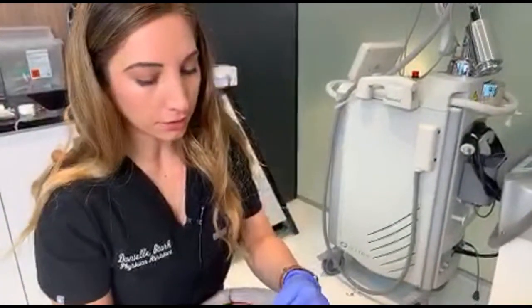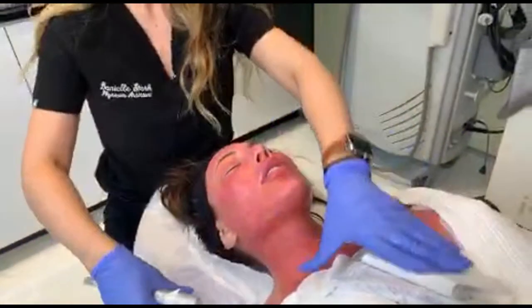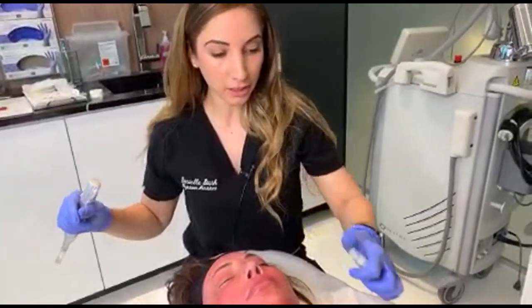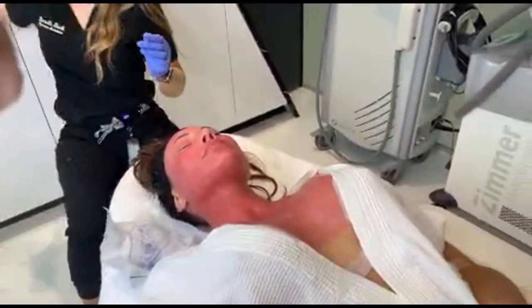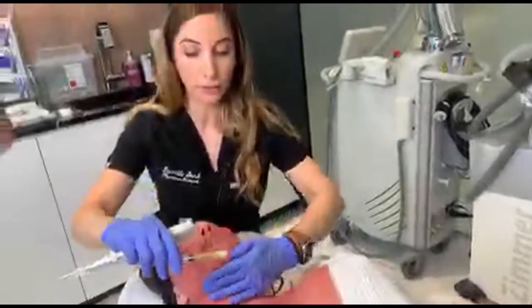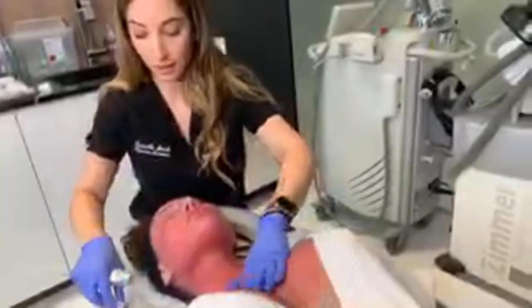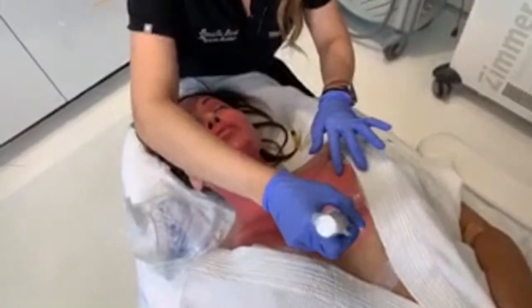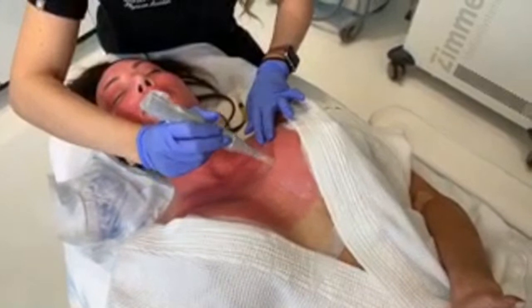And microrolling is really ideal for anyone as maintenance for fine line prevention. Someone who feels like they have larger pores or congestion in their skin, and definitely good for someone who has acne scarring. So that's a big one. Even just a small amount of needling, that micro trauma, that mechanical breaking down or breaking through the skin is going to really help to cause those scars to soften and cause the surface of the skin to look much smoother. We do really like microneedling there. So there's a lot of patients who are really good candidates for microrolling.